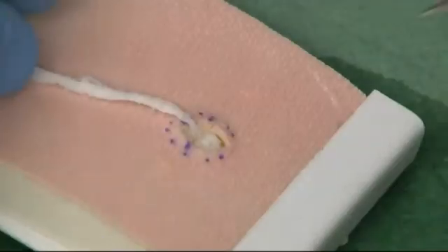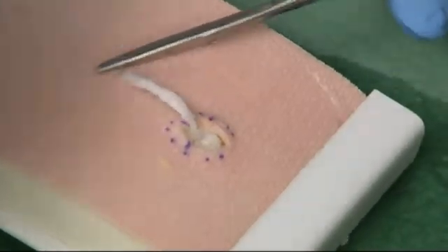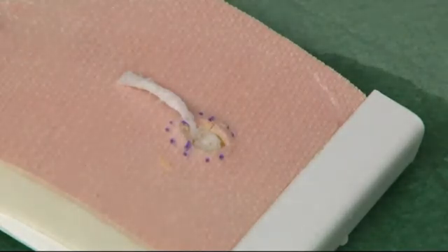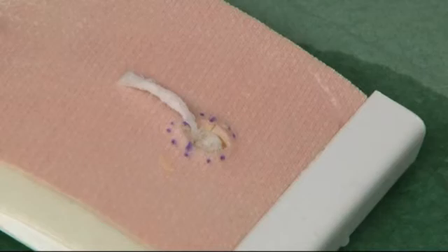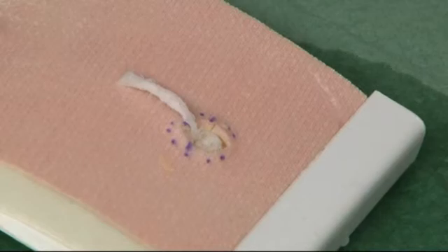Leave a small wick protruding from the open wound to encourage further drainage of material and also to facilitate dressing removal. Redress the abscess in two days.